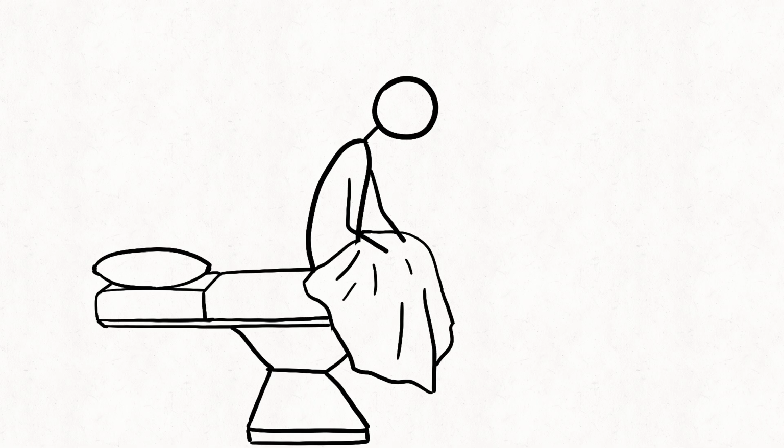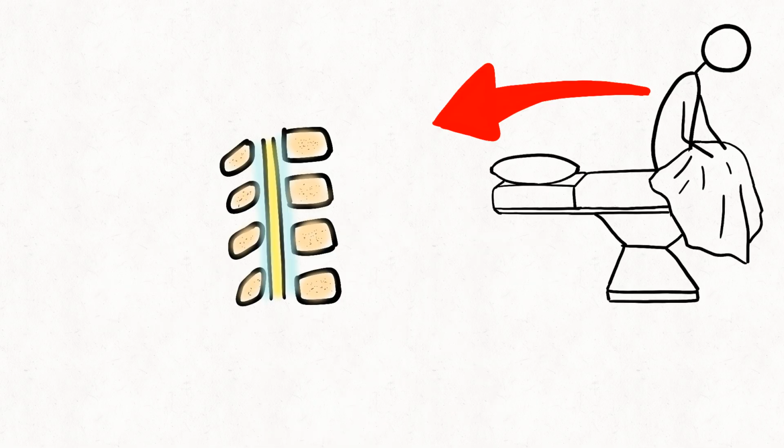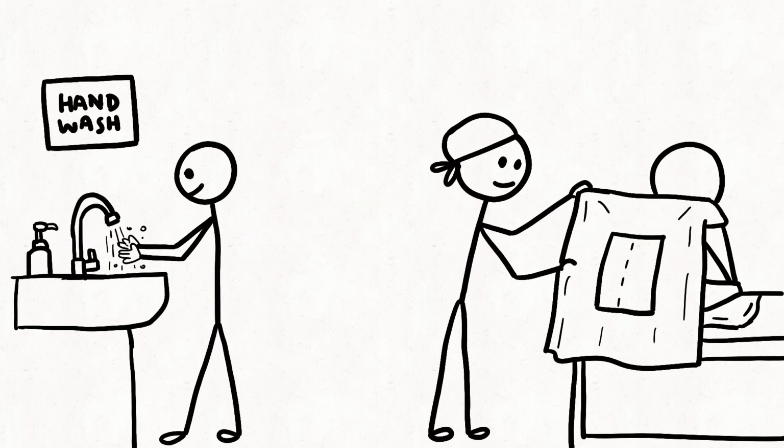Patient can be positioned sitting or lying on the side. The back is bent forward to open the spaces between the vertebrae. Strict sterile precautions are taken to prevent infection.